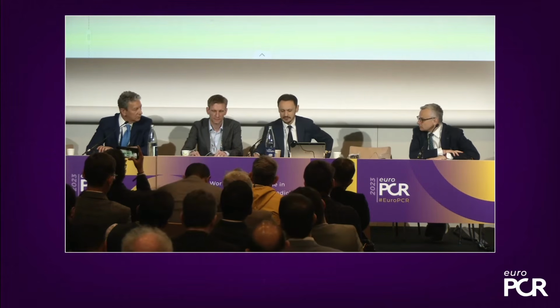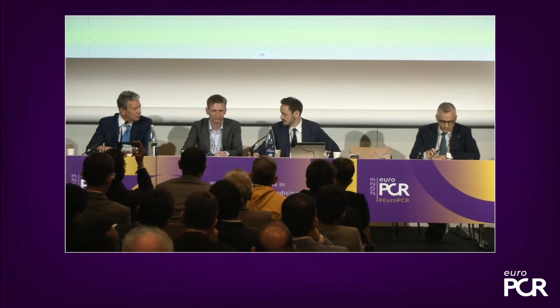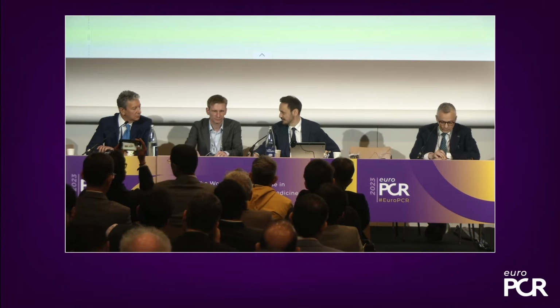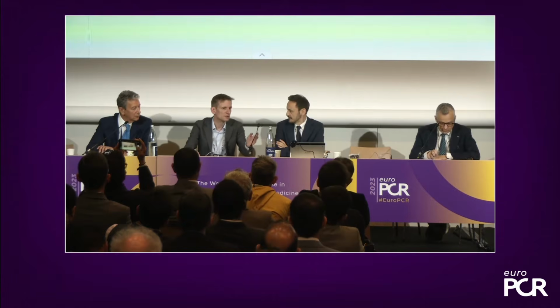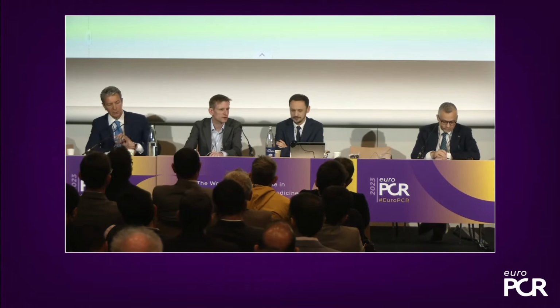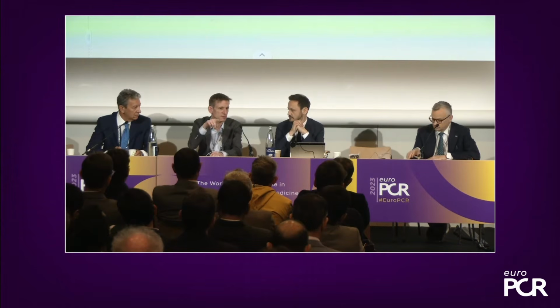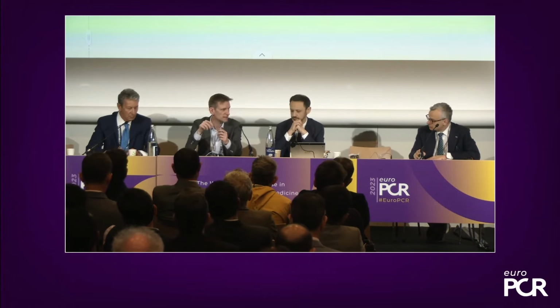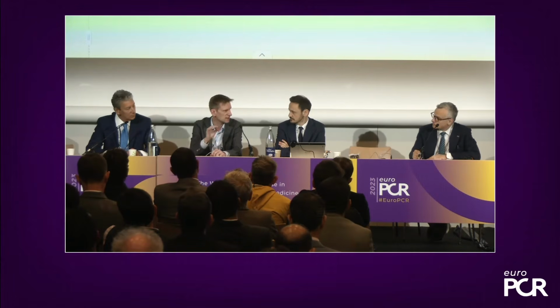And then I have another question. Do you see any real advantage of using a micropuncture set? Do you like it? Do you think it's just cosmetic? I mean, what's your opinion, and also the opinion of the rest of the panel? No, I don't do it anymore. I did it very shortly, for my transaxillary punctures, but then sometimes the needle is too flexible, so I also don't like it. I like the rigidity of the classical needle more.